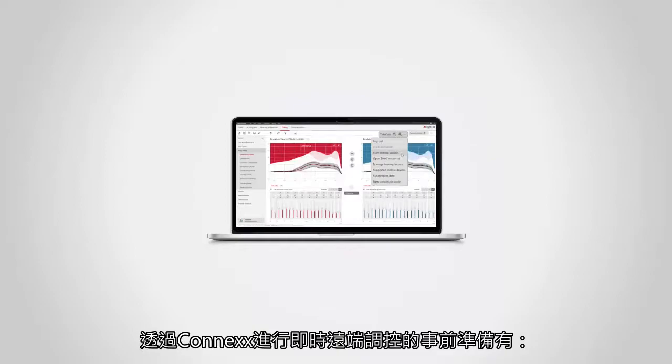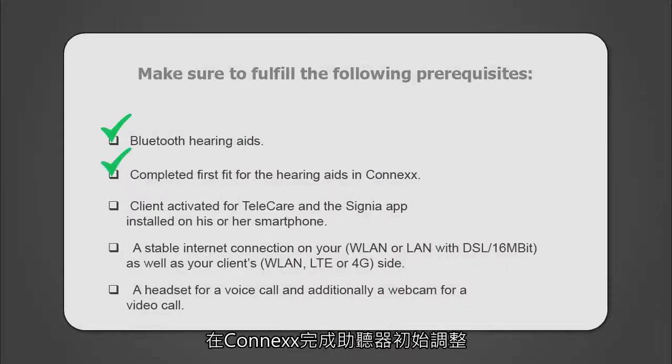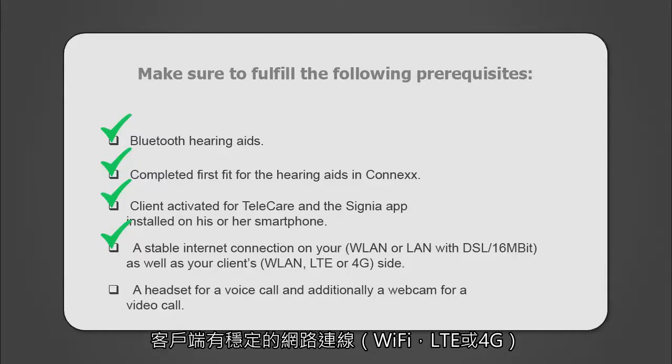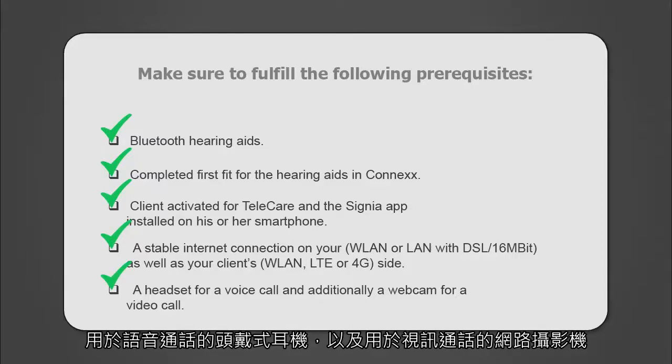Prerequisites for full live remote tuning via Connex: Bluetooth hearing aids with completed first fit, Connex Client activated for Telecare, and the Signia app installed on the client's smartphone. A stable internet connection on your client's side, a headset for a voice call, and additionally a webcam for a video call.